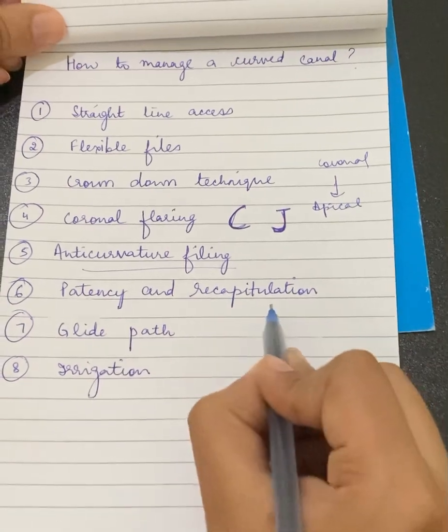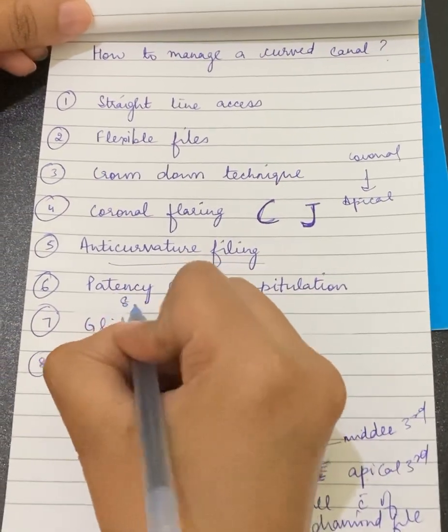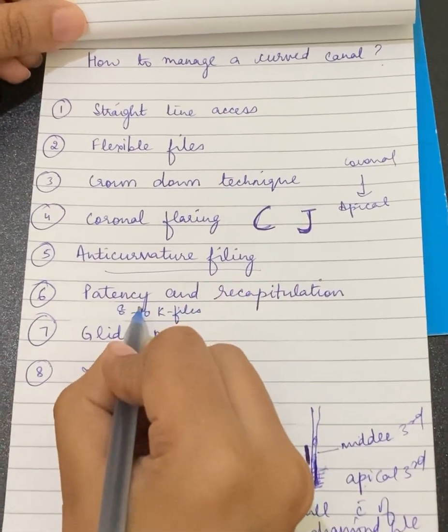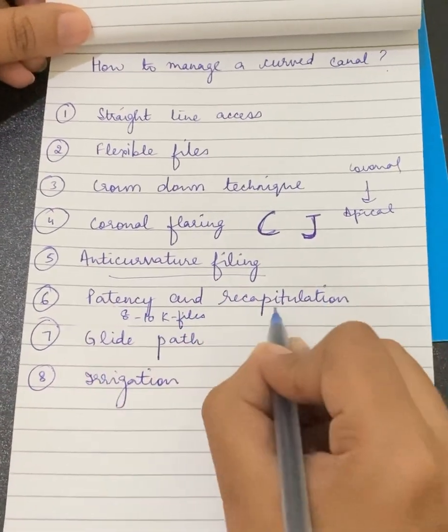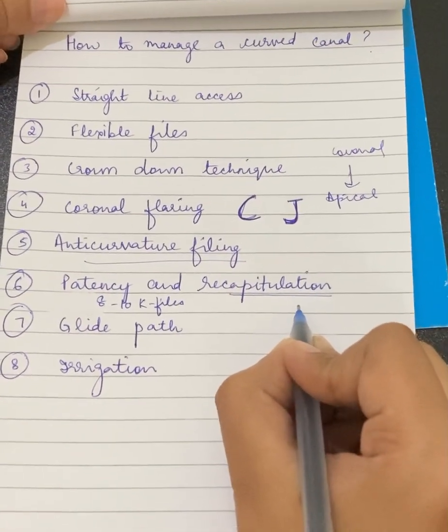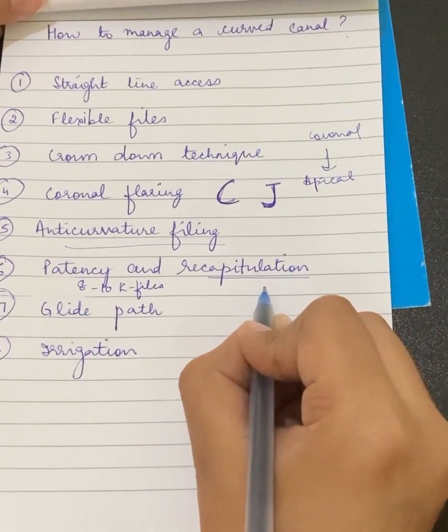Then we come to patency and recapitulation. Patency is nothing but taking number 8 or 10 K files till the working length again and again. And recapitulation is done with the smaller size files. This is done in order to avoid any kind of canal blockages.